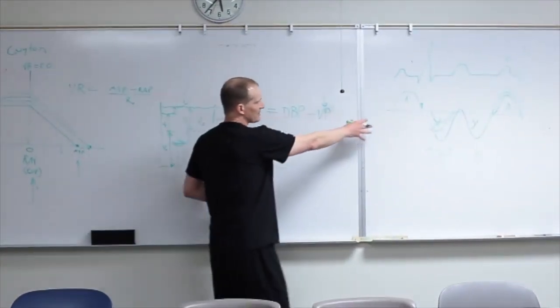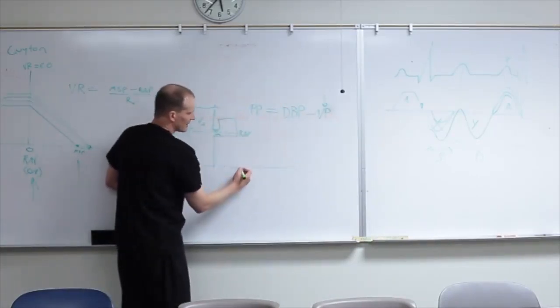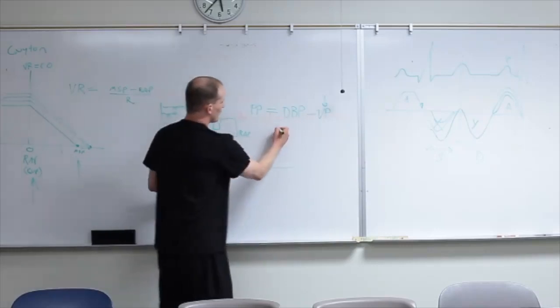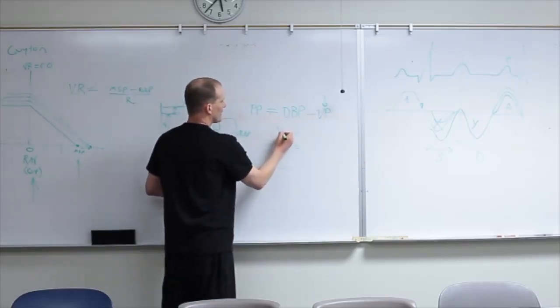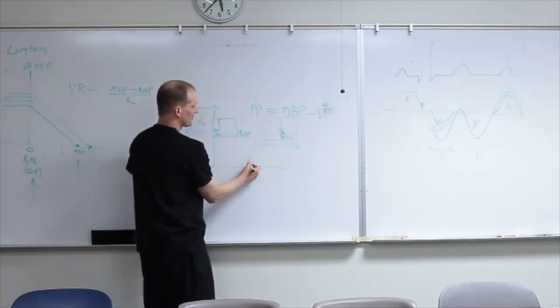Sorry, we're going to see the exact same thing going on as we have here, because as the right atria contracts, it is going to reflux blood up, right? Here's our IVC, here's our right atria, we drop our gate here, so the right atria contracts, blood comes up that way because there's no valve. So we get this, and it's called an A wave, okay?